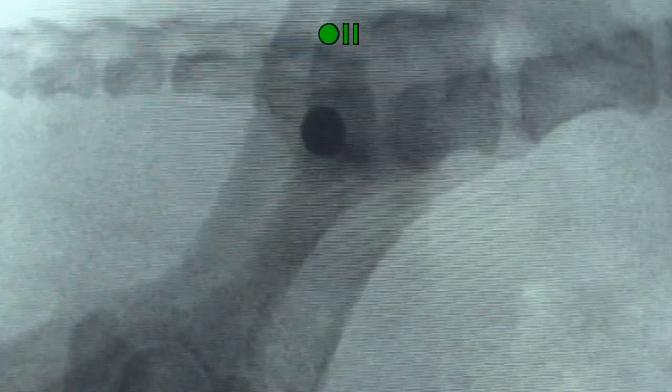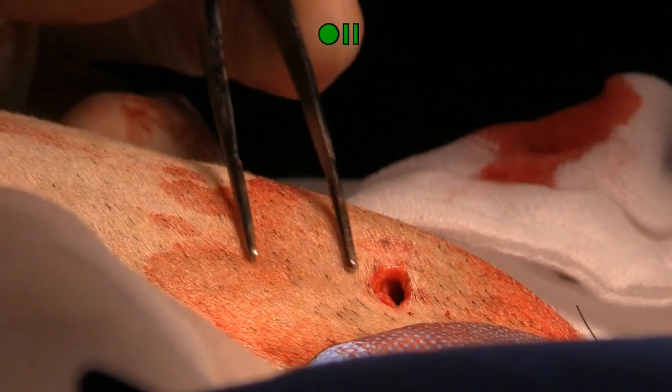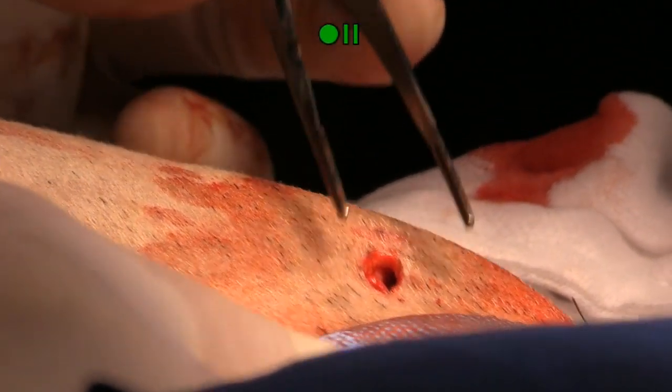So I don't know if Charlie can zoom in on the size of the incision that we've got there. So just zooming in here, see if I can find that. So that's the entire incision right there. So everything was done through that small hole. Yeah, going to get my forceps. So we can close this essentially just with a cruciate.